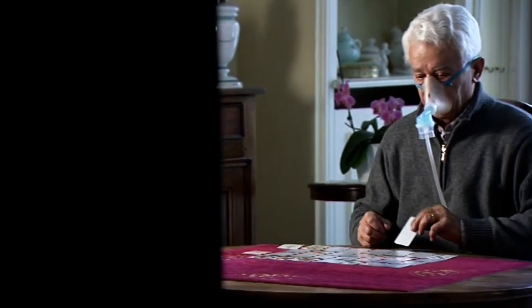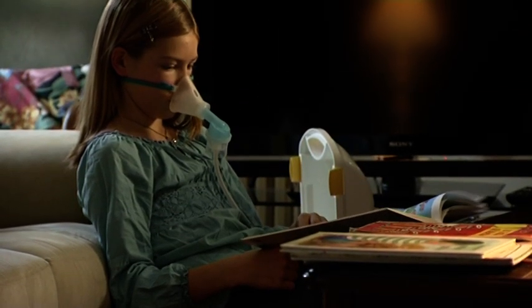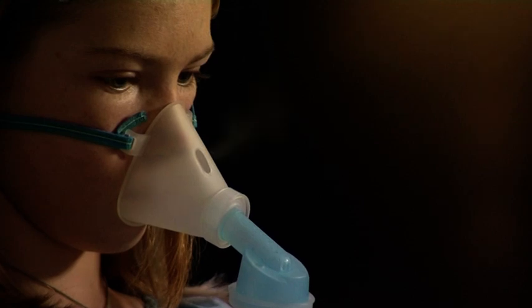If the mouthpiece or nosepiece cannot be used, a nebulizing mask is available in the kit, either for adult or child. For any further information, do not hesitate to contact your pharmacist or your supplier.